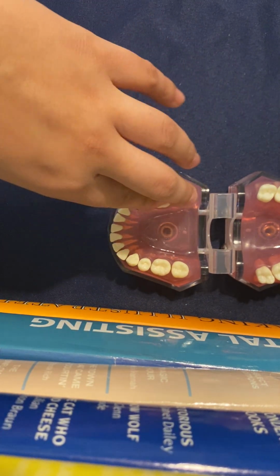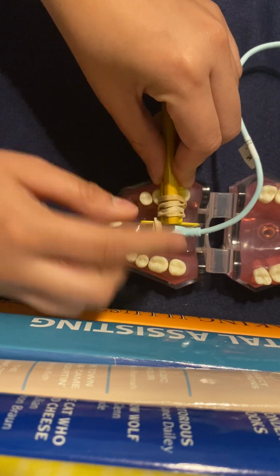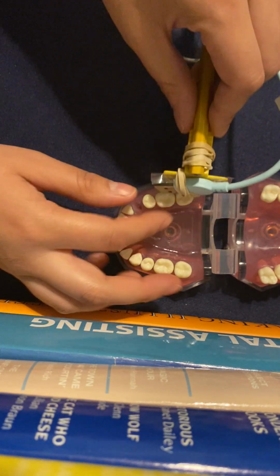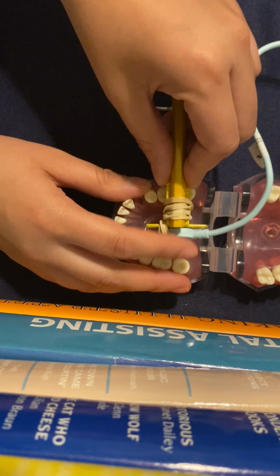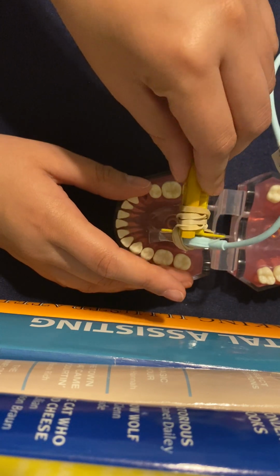So center on the second molar, and the teeth that you're gonna wanna see are the first and second molar, crown, and apices. So you're gonna wanna center it. Pretend like that's the center. You want to get in that midline. You're going to kind of want to push that tongue over a little bit. If they have tori, you can put it on the tongue a little bit, I think.